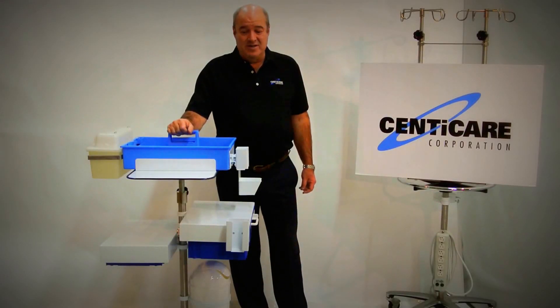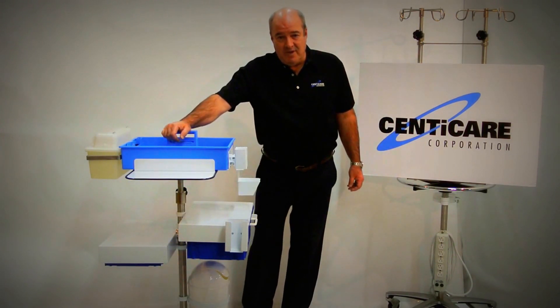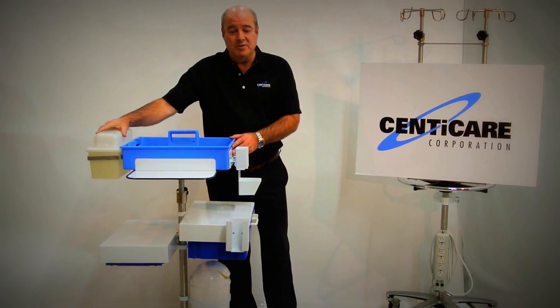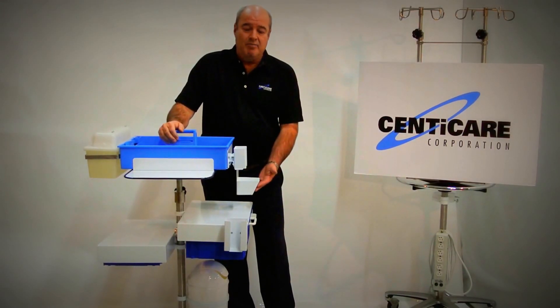Here's the next in a series of carts that we make. This one is specifically set up for the phlebotomy teams of hospitals. This cart uses a removable tray. It has a writing surface. We do incorporate in this a sharps container. This one is set up to incorporate a PDA and a printer bracket.